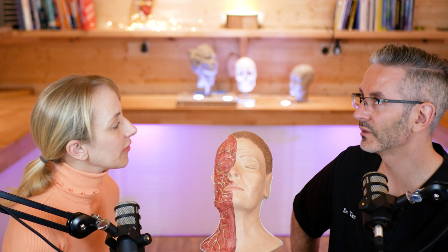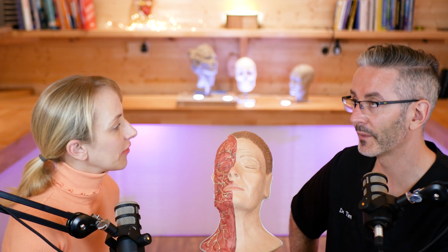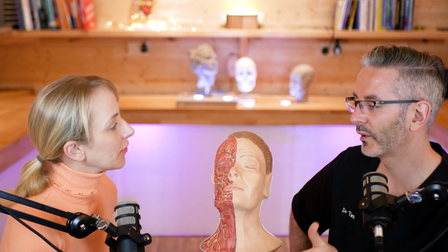So, there's supposed to be a 1 in 15,000 chance of doing it. So you're still, what is it, 1 in 150 or 1 in whatever? My maths will probably be slightly off, but basically you're much more likely to do it by being a little bit too deep. So I would just ask yourself the question, how deep do I really need to be?